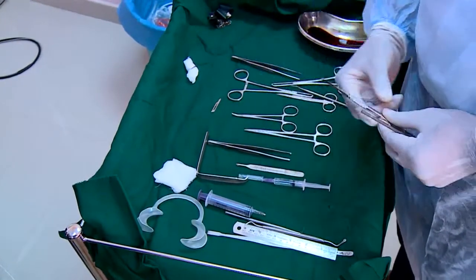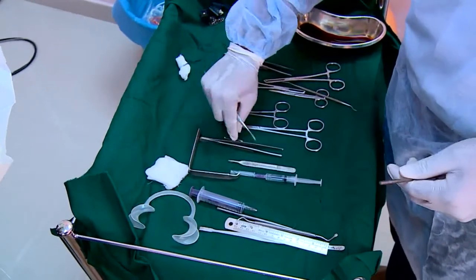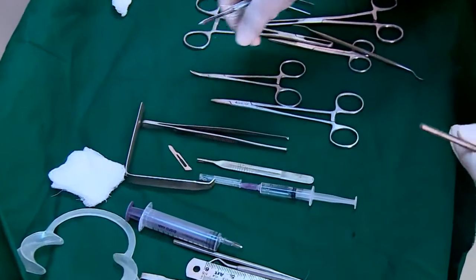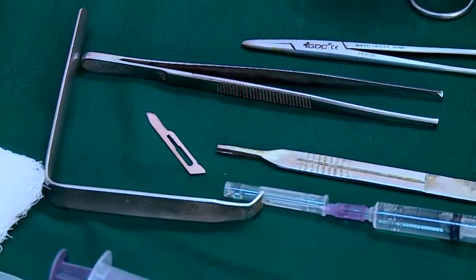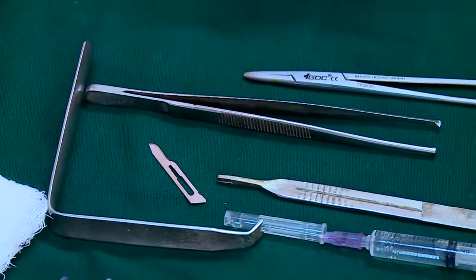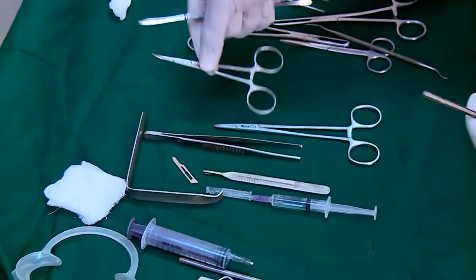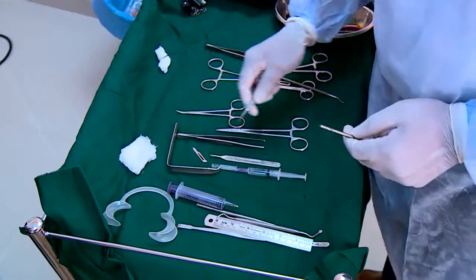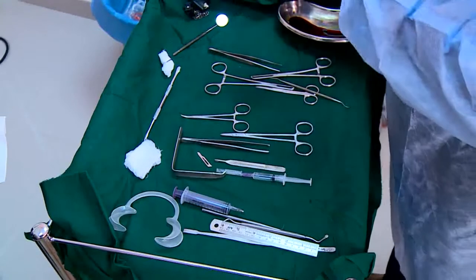Is the armamentarium clear? The LA is done. Then we need a BP blade handle and a number 15 BP blade. Then we need a tooth forceps to hold the specimen and get it out. Following this, if we have to close the wound, we need a needle holder. Meanwhile, during the biopsy, we may end up with some bleeding here and there because of the rich vascular supply to these lesions. So if we find a small artery or arteriole, we need a mosquito artery forceps to clip it and hold it. So this is a very simple procedure with simple armamentarium and a few gauze pieces, of course, to achieve some hemostasis in between.